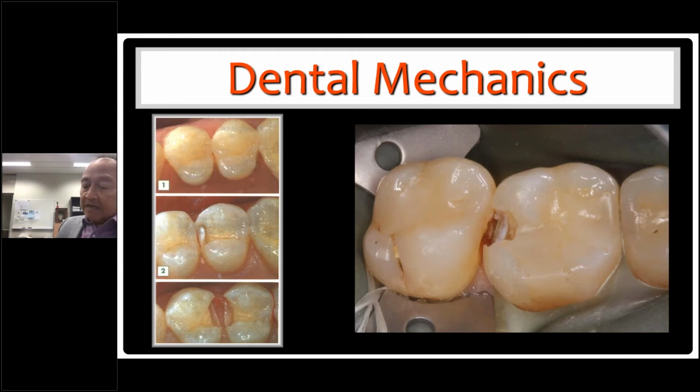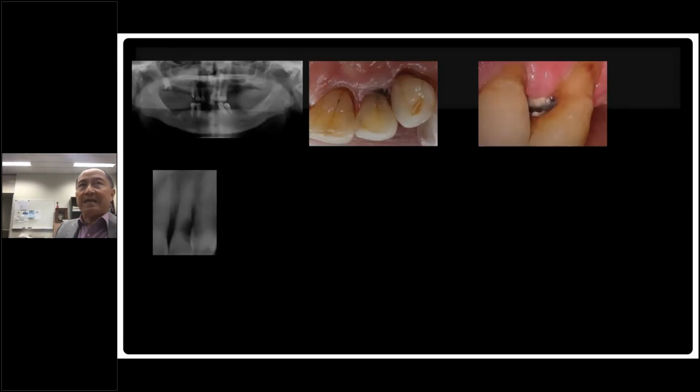Once the powder meets the liquid, ions like aluminum and strontium get leached out of it, and that forms the matrix that helps solidify it. Bear that very simple chemistry in mind, because it has clinical implications for you to understand.